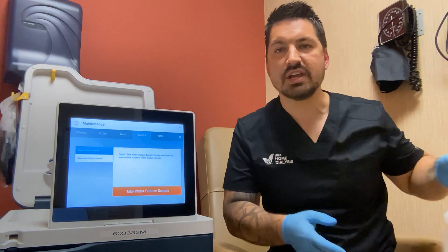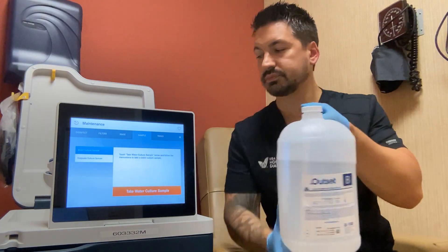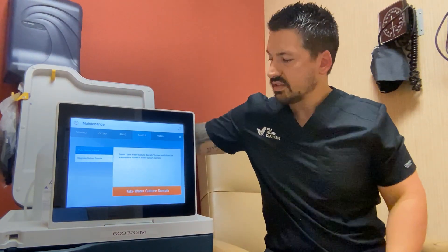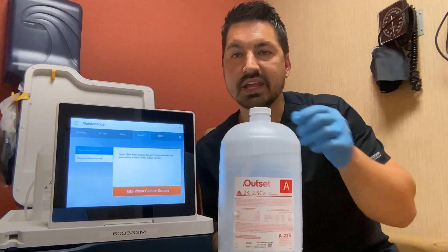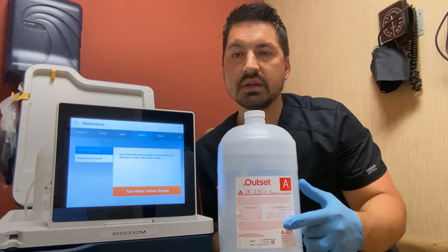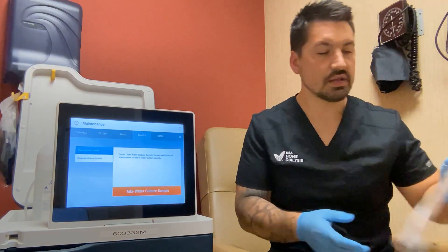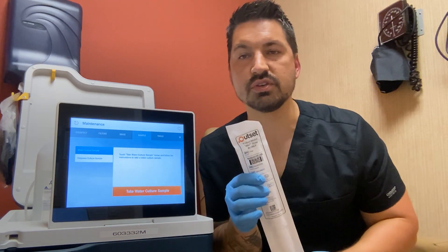Here are some of the supplies you'll need for the dialysate culture that you don't need for the water culture collection, as seen in the other video. Grab your jug of bicarb — it has a blue label, and the expiration date is at the bottom. Place that behind the machine next to the blue dialysate cap coupling. You'll also need a red acid jug — this one happens to be a 2K, meaning 2 potassium and 2.5 calcium, with the expiration date at the bottom. Place it next to the red coupling. You also need one package of straws, which contains two straws and is shipped to you by Outset.